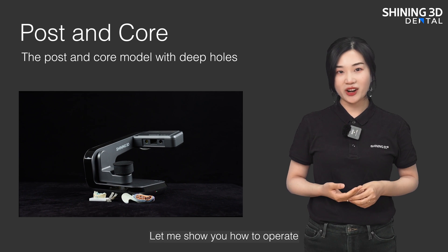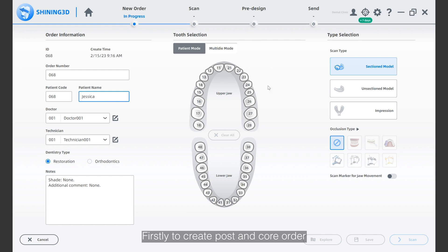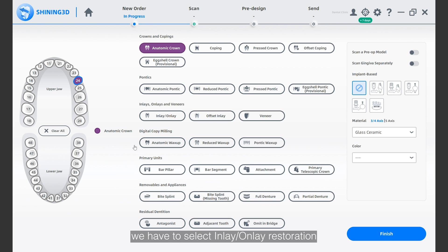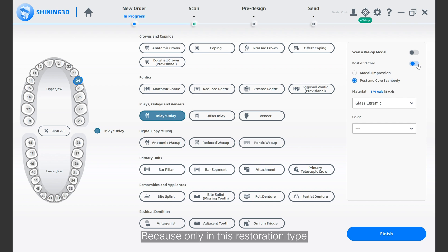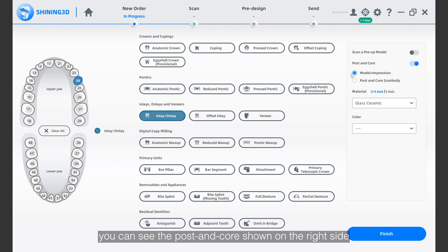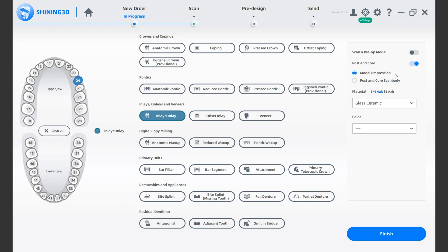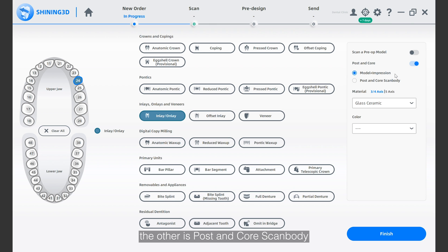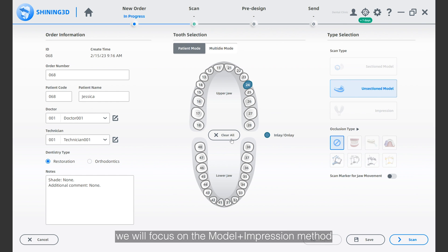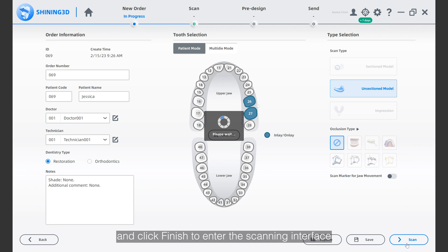Let me show you how to operate. Firstly, to create a post and core order, you have to select inlay/onlay restoration, because only in that restoration type can you see the post and core option on the right side. There are two methods to scan a post and core case: one is model and impression, the other is post and core scan body. Today we will focus on the model and impression method. Select the model and impression button and click finish to enter the scanning interface.